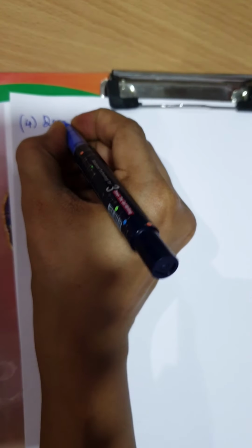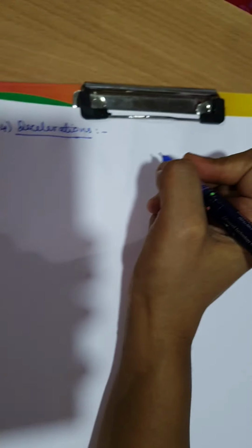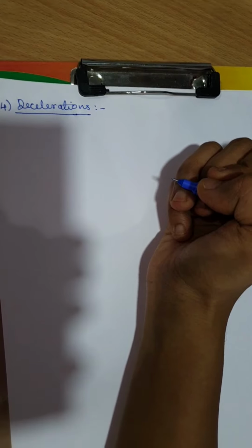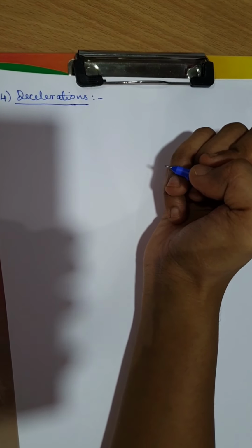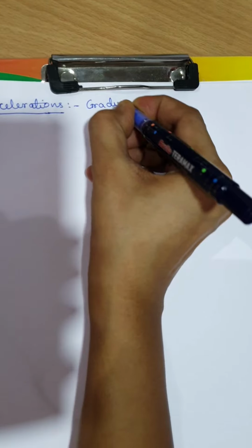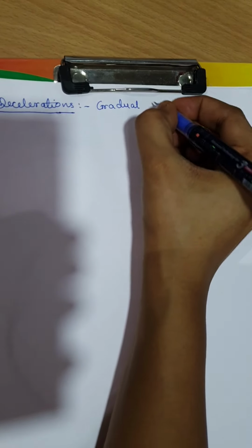Now we will move forward to the 4th point, the decelerations. Sometimes in the CTG or on the NST, we see a gradual lowering of the fetal heart rate. So there is a gradual decline in the fetal heart rate, and this gradual decline is called a deceleration.